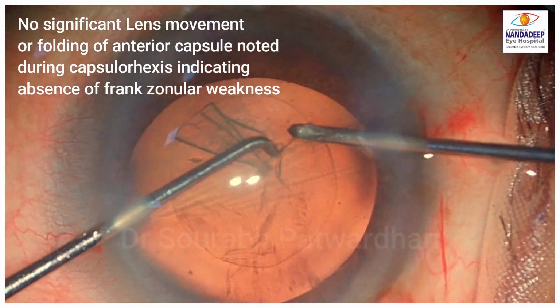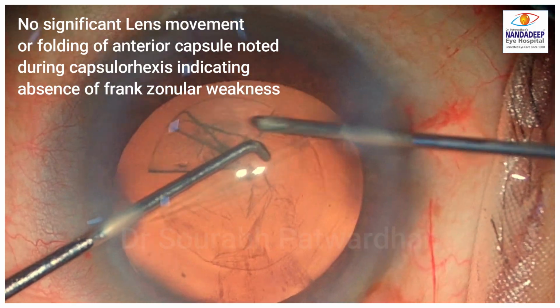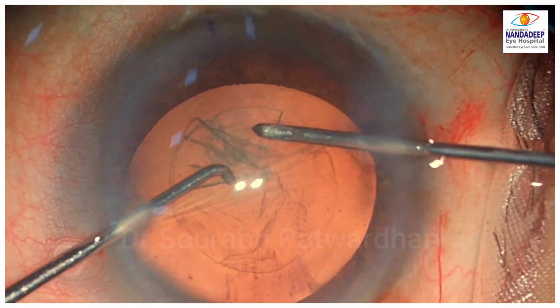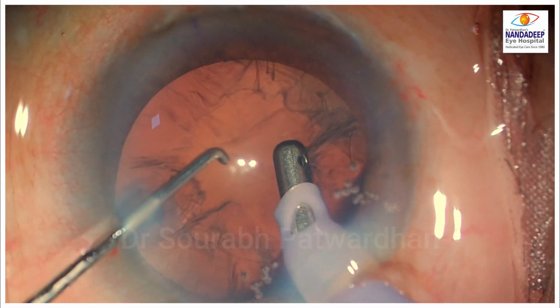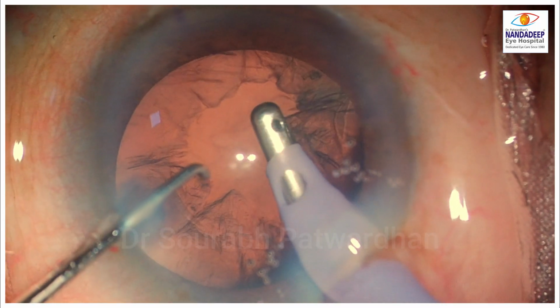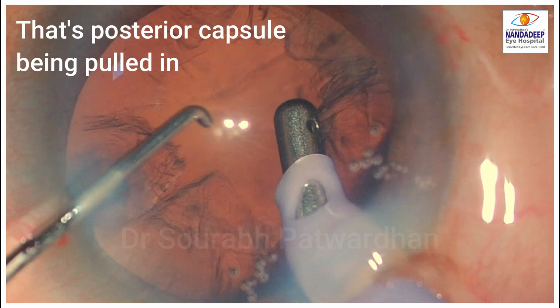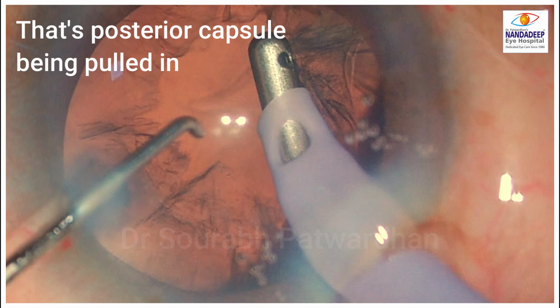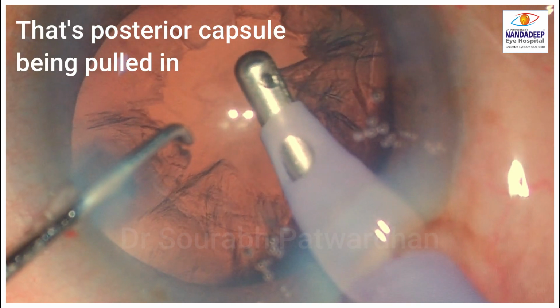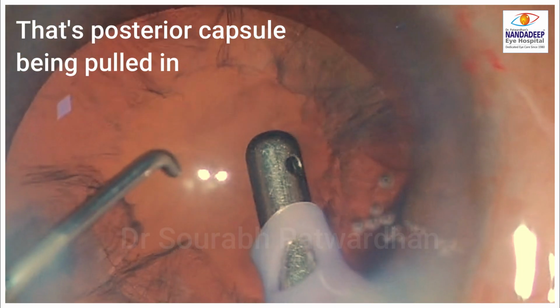But as we move on to phaco and cortex aspiration, we notice that when we try to remove the cortex, there is posterior capsule being pulled in along with the cortex, indicating that it is not supported by the posterior zonular complex.